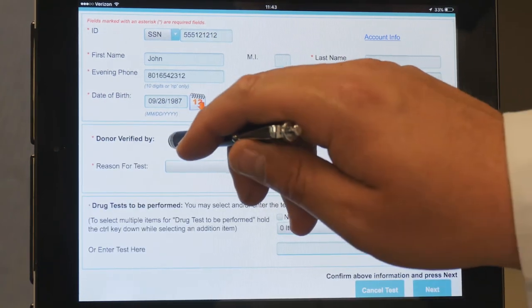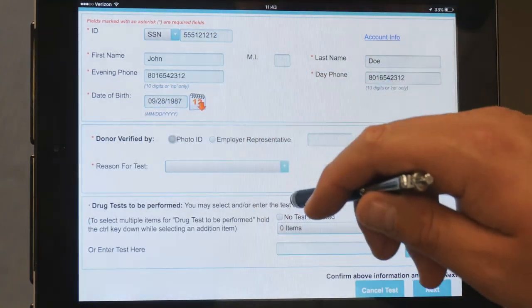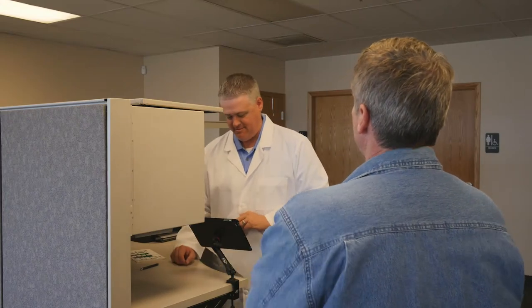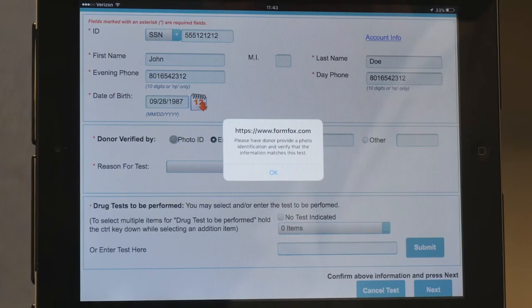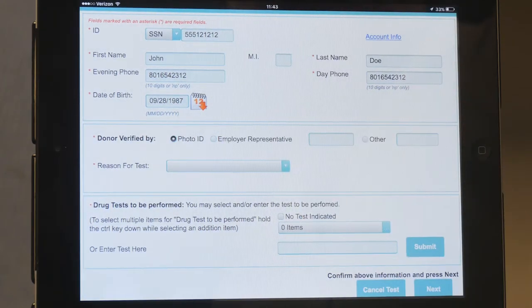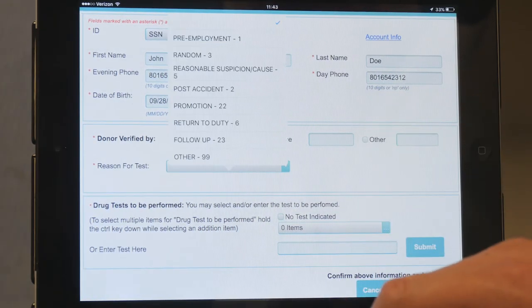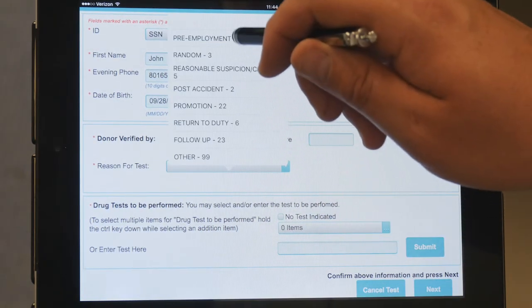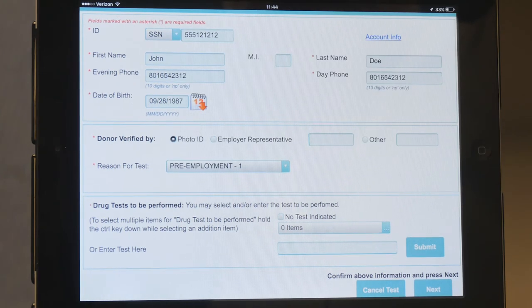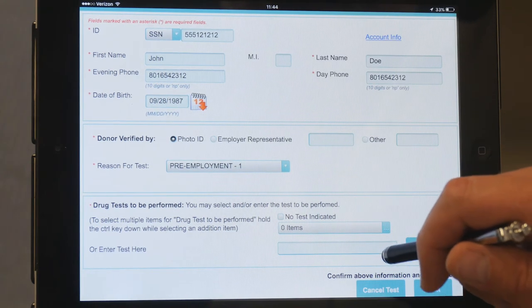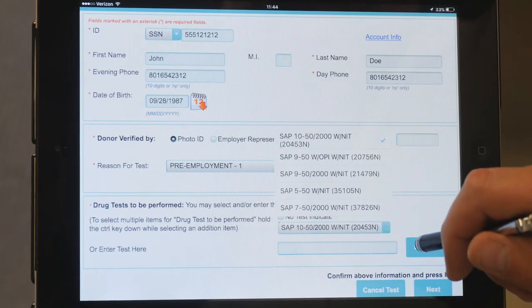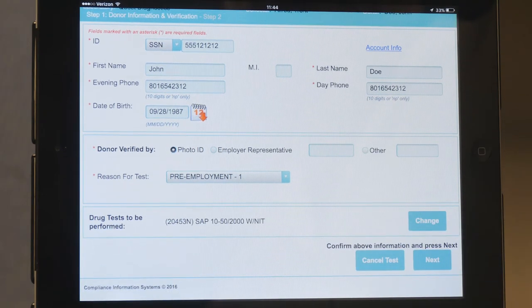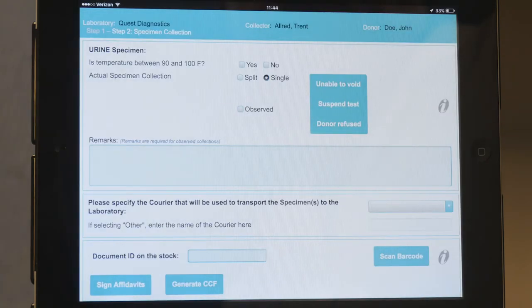Verify identification by viewing the donor's photo ID and selecting Photo ID. If there are extra fields requiring more information to be entered, enter the information. If the laboratory account is linked to only one drug test panel, FormFox will automatically select that panel. If the laboratory account is linked with multiple drug test profiles, select the preferred panel by tapping on the text of the preferred panel and hitting Submit.